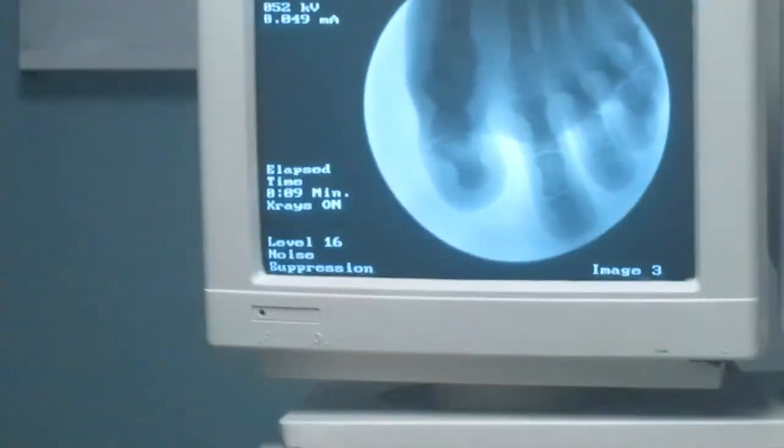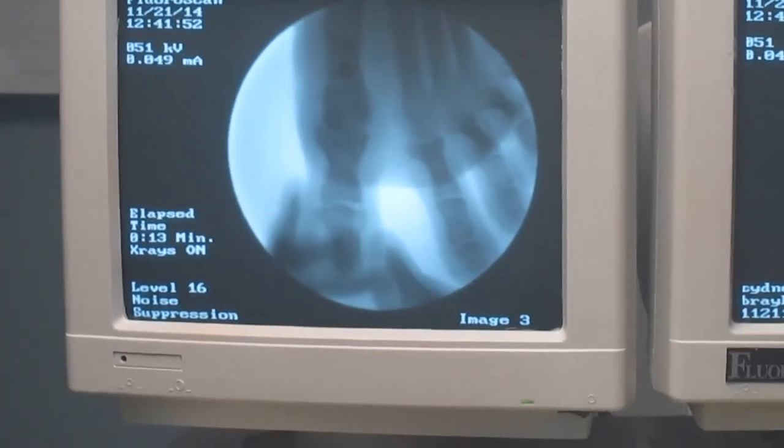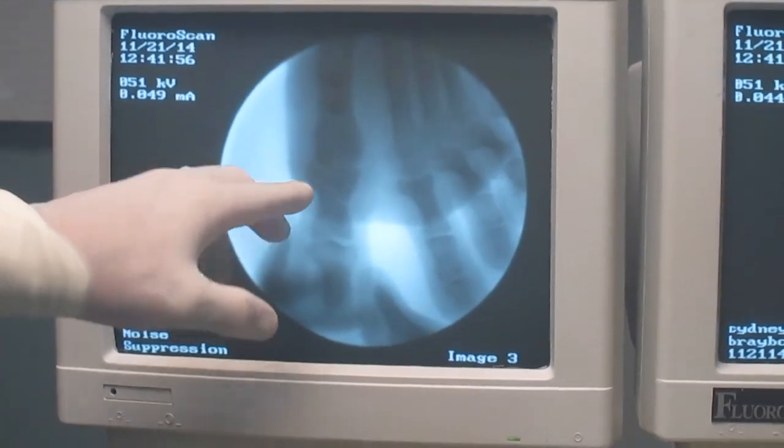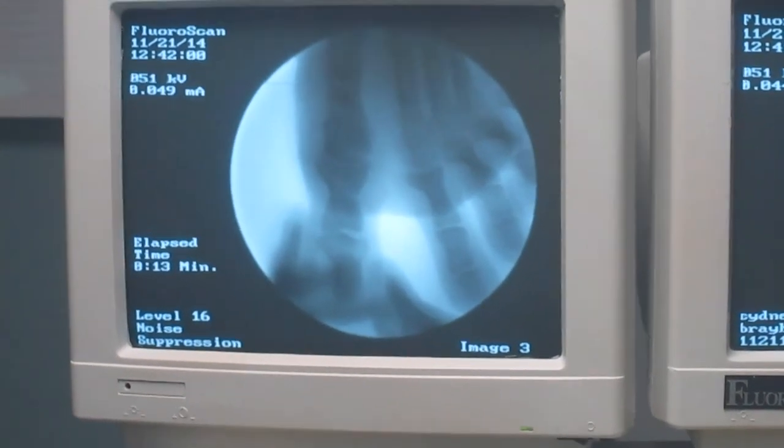And you can always check this. Look at her C-arm. You can see her toe's already going down. But look at the C-arm. You see my cut. Here's my cut here if you look inside. See the angle I've got of that. What I'm doing is cutting through this lateral part. I'm leaving the dorsal medial part intact so the toe goes down and over to the lateral side.